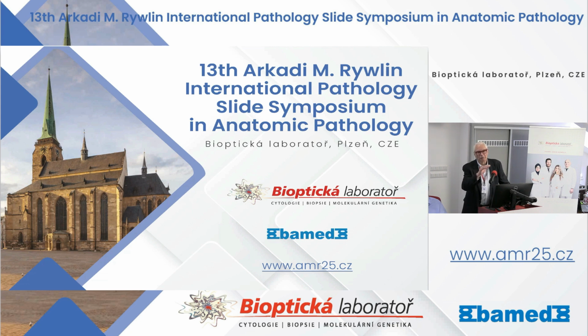I might even ask for unstained slides at the beginning, because most of these cell blocks, we don't have much material we're dealing with, so it becomes very precious material, and I try to be very judicious as to what stains I'm ordering. And hopefully with those 5 or 6 markers, depending on one of those being positively stained, I can go on with a second tier of markers to become even more specific, or ask for molecular analysis on some of these. Yeah. I don't know if that answered it or not. Any other questions or comments?